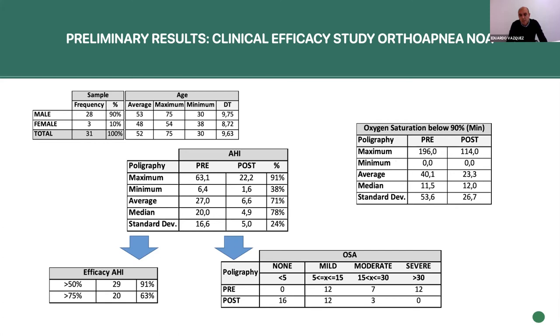But you have to think that 60% is the starting point. And with the NOA, that means that when the patient opened the mouth to 10 millimeters, they were really at 70%. But they don't have to be at 70% all night, because in some moments during the night, when they have the mouth closed, they're going to be at 60%. And when they open the mouth, which you know in some cases can decrease the efficacy of the device, they're going to go to that more protrusive position, which is 70%. So in some moments of the night they're going to be at 70%, some moments at 60%. But we don't oblige the patient to always be at 70%, which we feel is going to provide more comfort for the patient and also decrease the possibility of the occurrence of side effects.